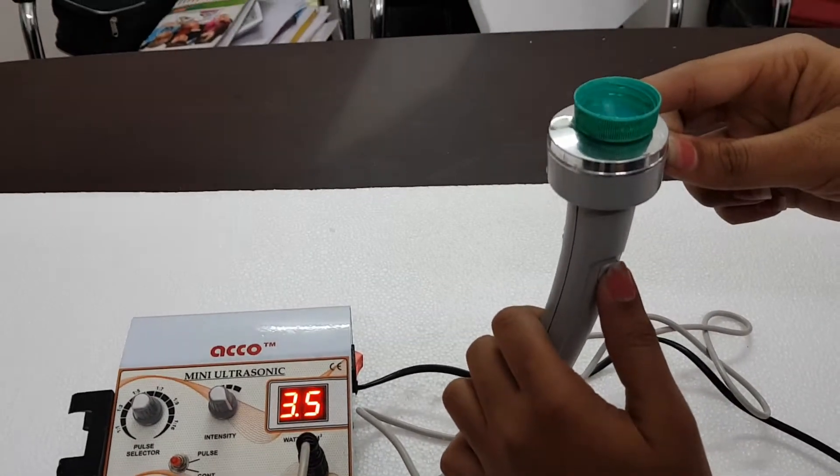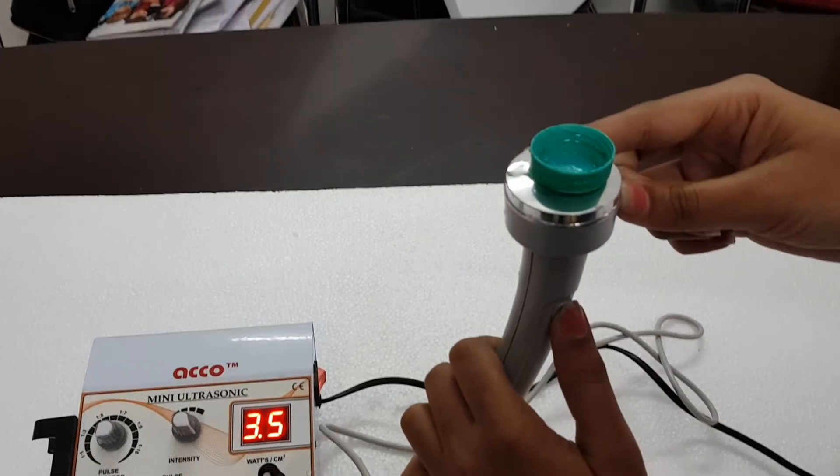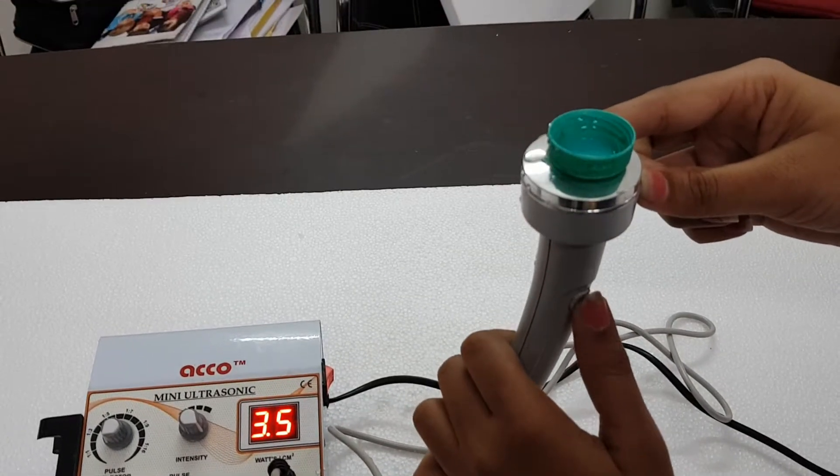Kindly press this button to continue the treatment. Release the button to stop the treatment.